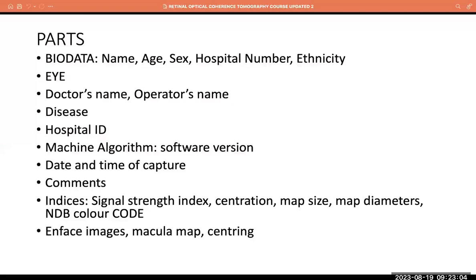And he's presenting with reduced vision, media is clear, and then on the retina, you look, there are no new vessels, there are no bleeds, the macula looks a little bit swollen, and you have exudates around the macula. So your thought is different. You won't just say, oh, it's a retinal OCT. You already have a thought of, oh, this could be diabetic macular edema in the second person.